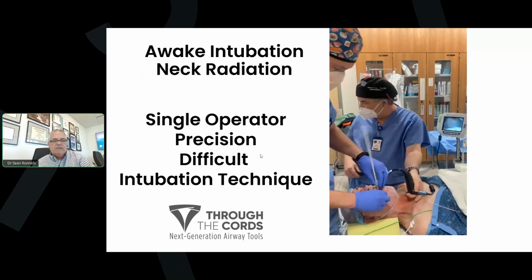So this is single operator, precision intubation, and it's an excellent difficult intubation technique. This is the standard technique at the University of Utah that we're using for a lot of our awake intubations.